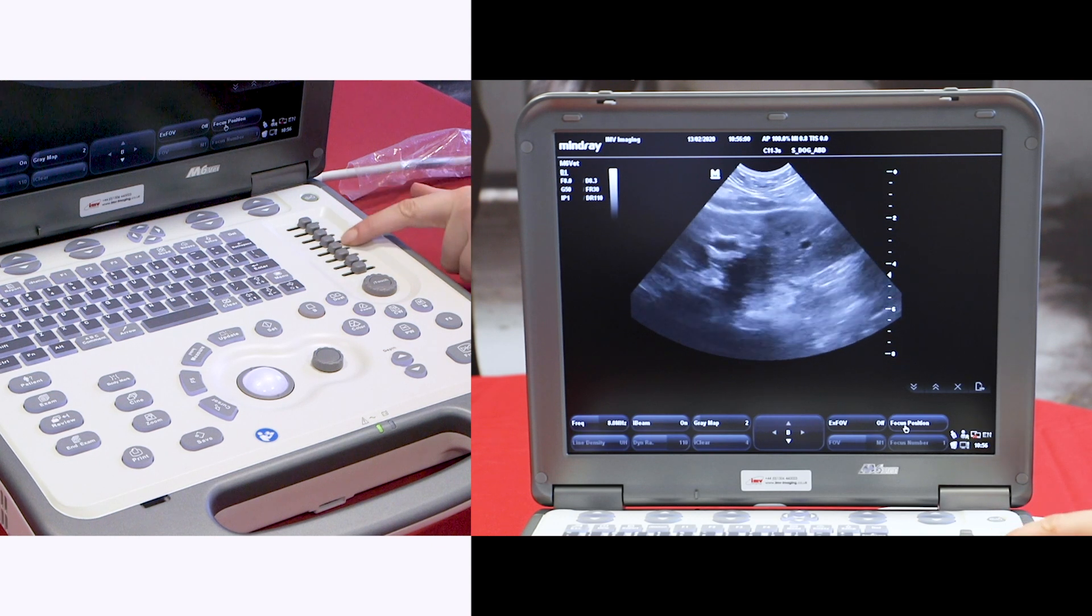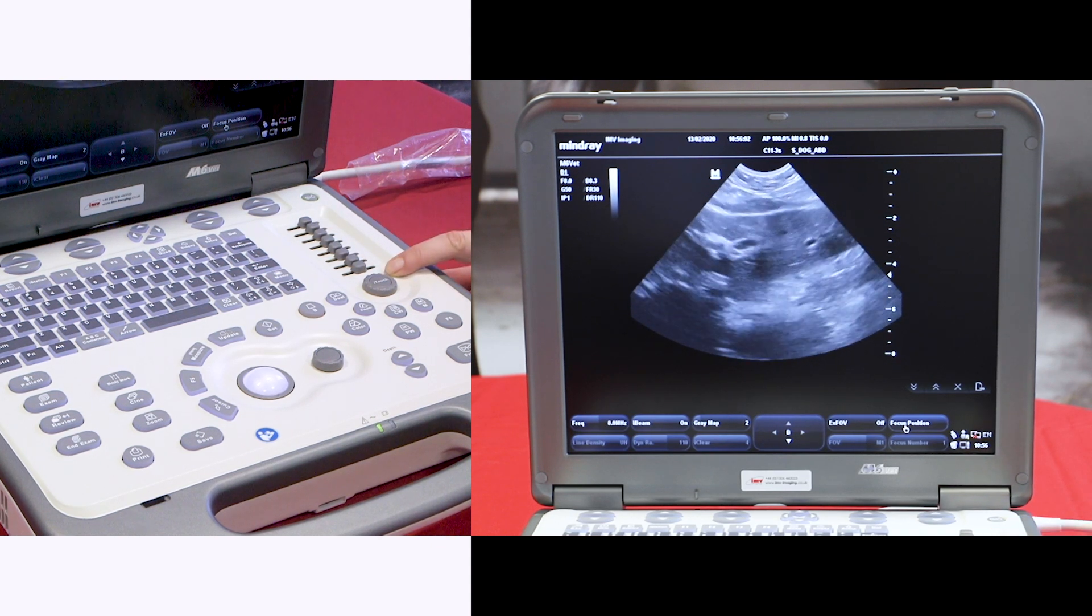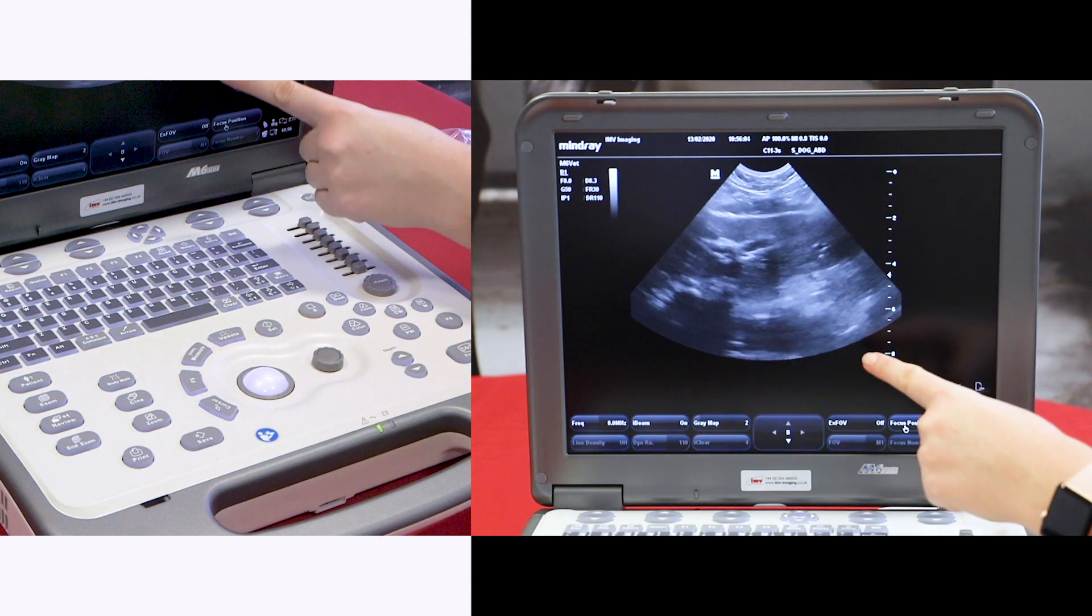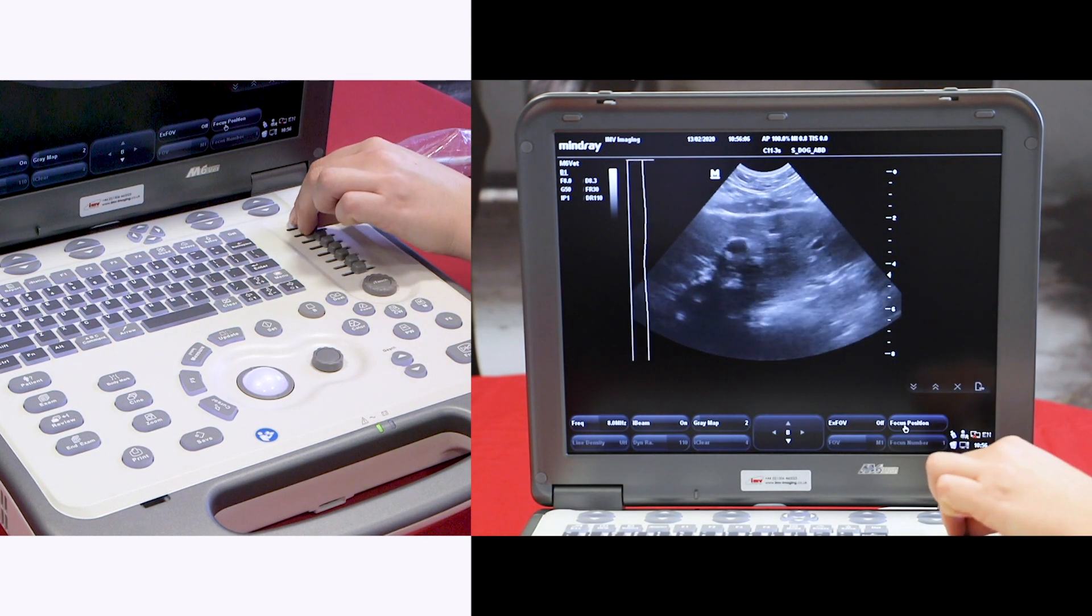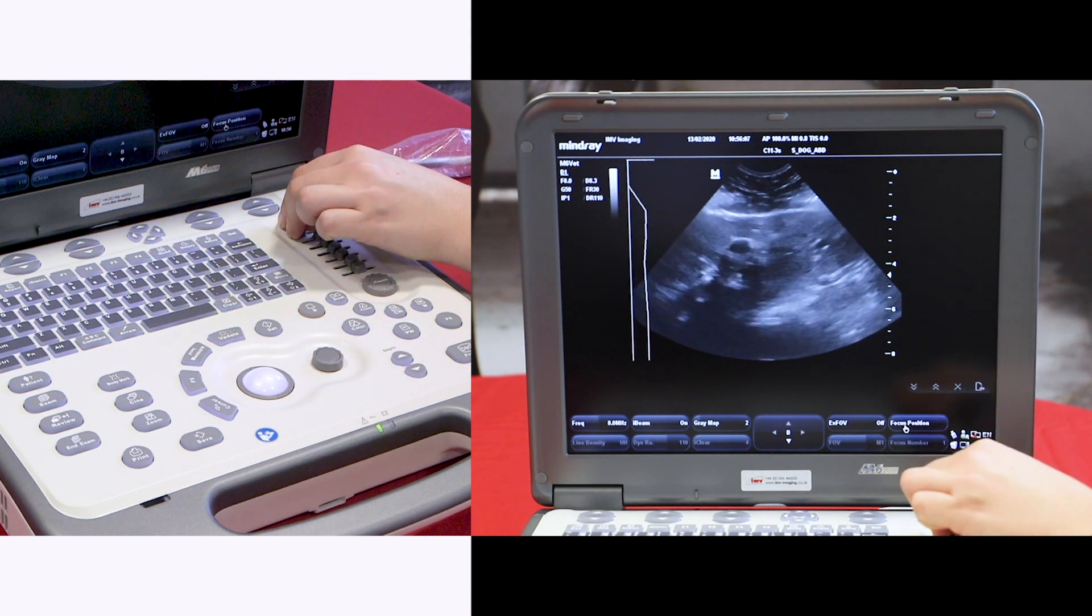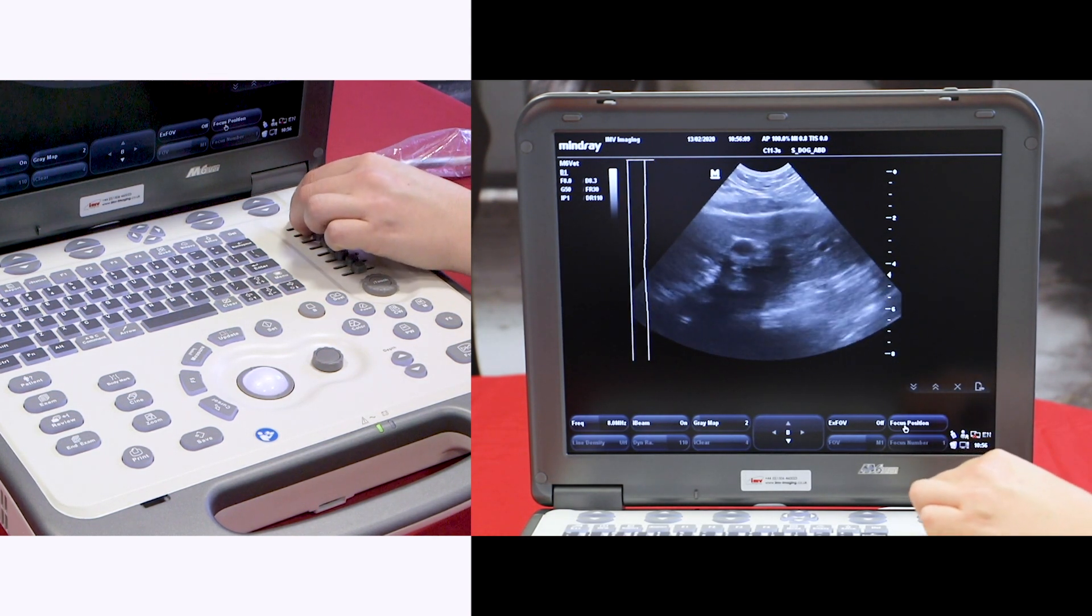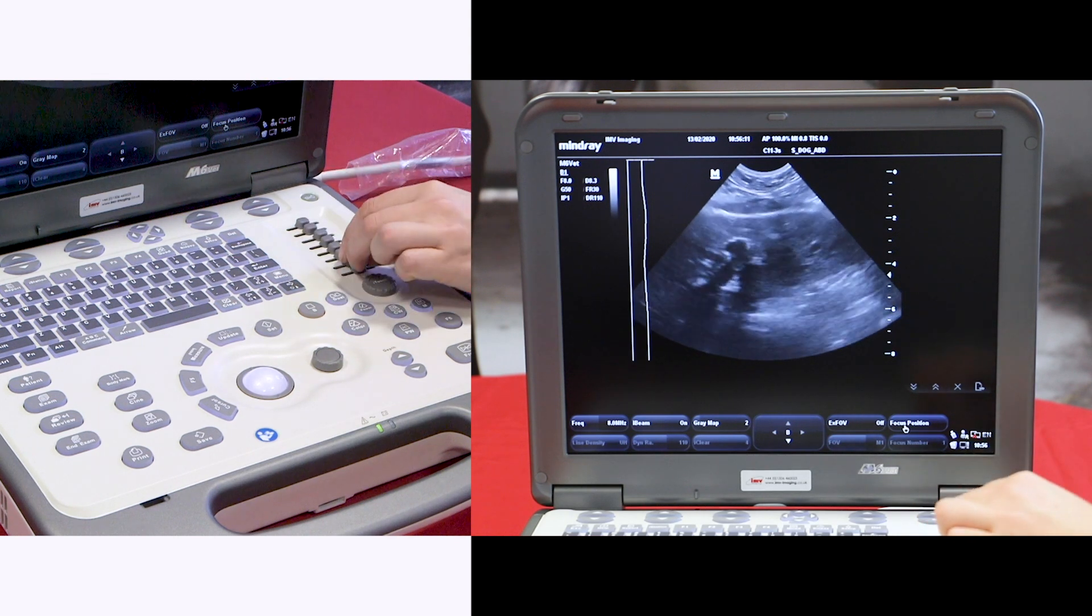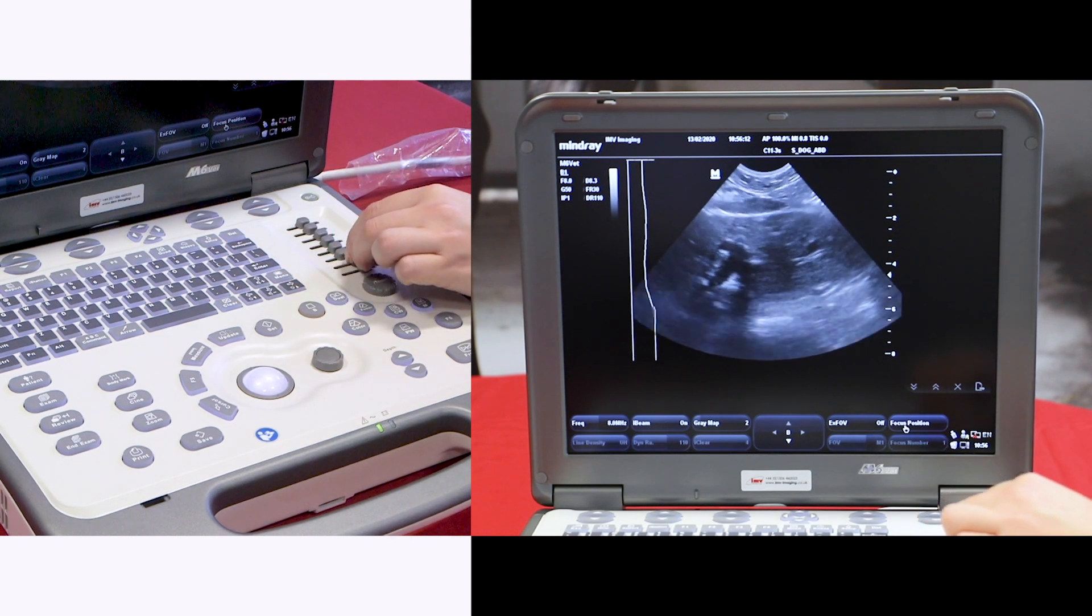The time gain compensation sliders should be set so that you have an evenly gained image throughout the screen. At the top it will change the image brightness closest to the probe and at the bottom furthest away from the probe.